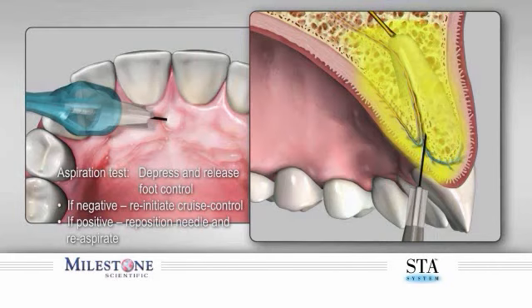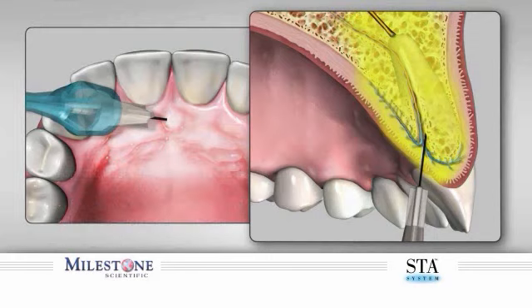If there was a positive aspiration, as determined by observing blood in the hub or tubing, reposition the needle and then re-aspirate before continuing. After you have delivered the proper amount of anesthetic, you will notice diffuse blanching of the tissue. Once the suggested volume of anesthetic solution is dispensed, the needle will be removed.